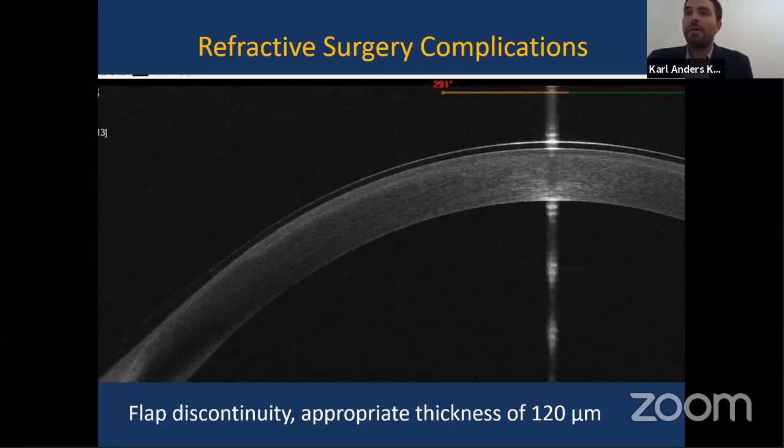So now we had to think about the different possibilities for managing this patient. First of all, the first thing to do is wait. You have to be sure that no epithelial cells grow in the interface. We gave ourselves about 6 months. The patient was very comfortable, the levels of anxiety actually went down a lot, so we were quite happy with that.